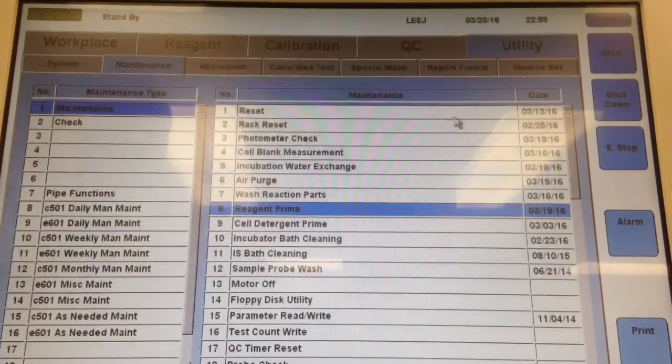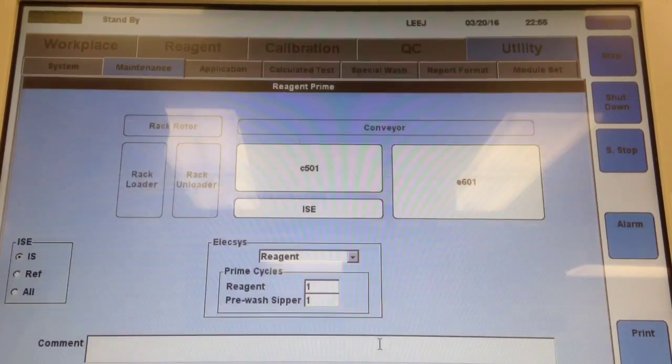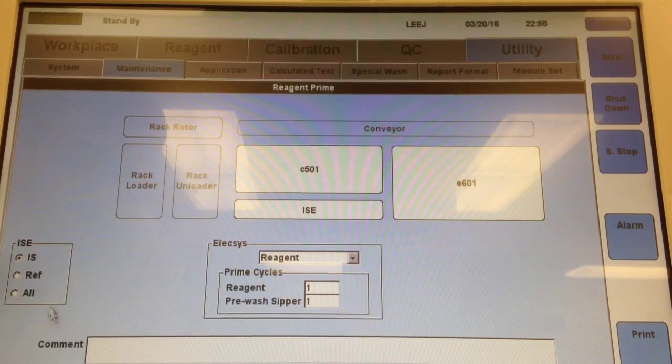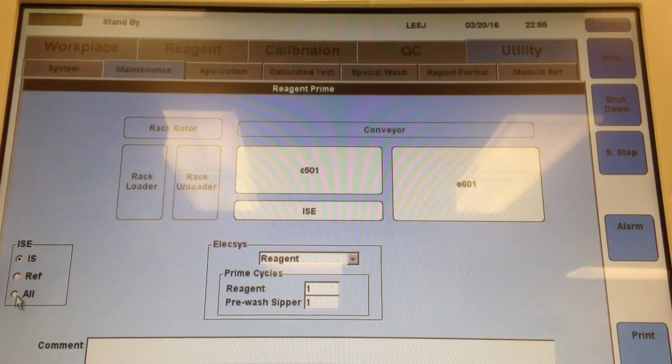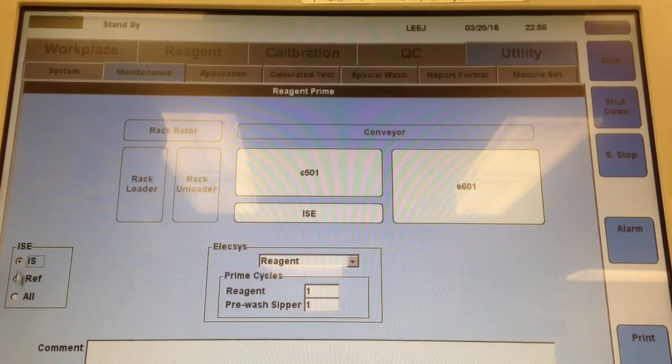Starting in Workplace, go to Utility, then Maintenance, and select Reagent Prime. You could do it a couple times if you wanted to, but I'm just going to do it once, which should be enough paired with the other things I'm going to do.